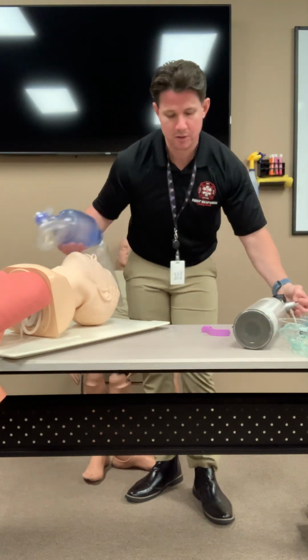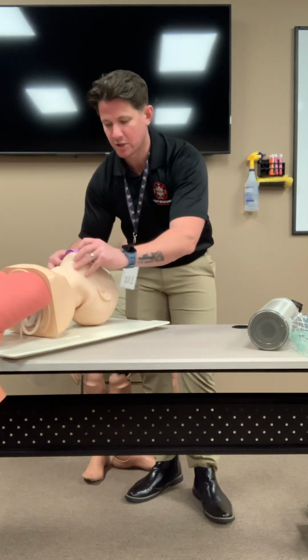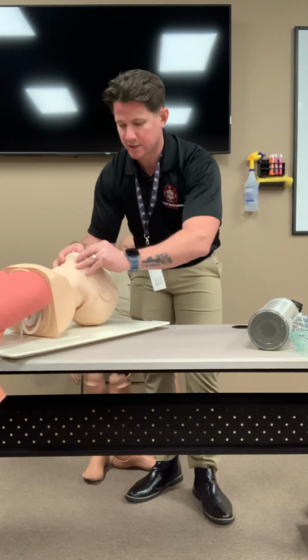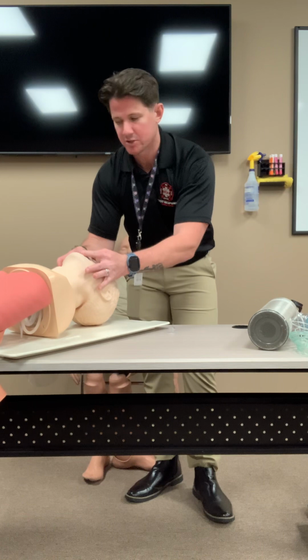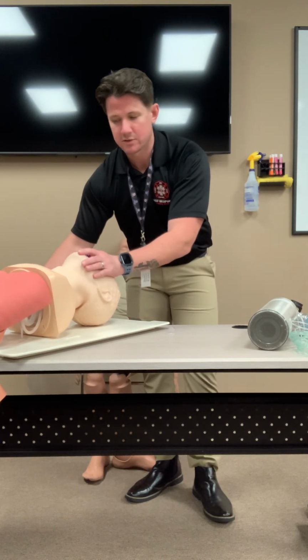At this time, I'm also gonna insert an oral airway adjunct. This is key, right? We need this oral airway adjunct to displace that tongue. So just like you put that oral airway adjunct in, just like I showed you, right? Does the patient have a gag reflex? No gag reflex, right? Okay, good.